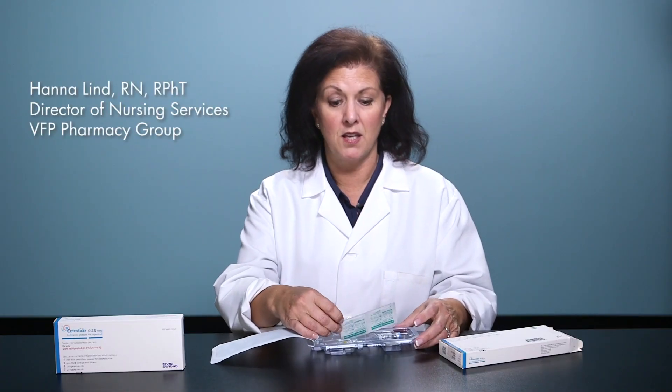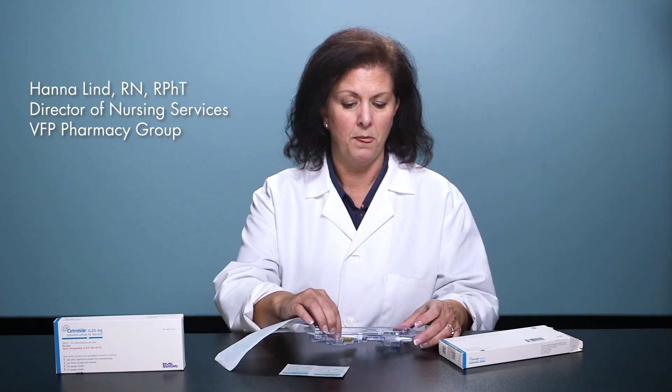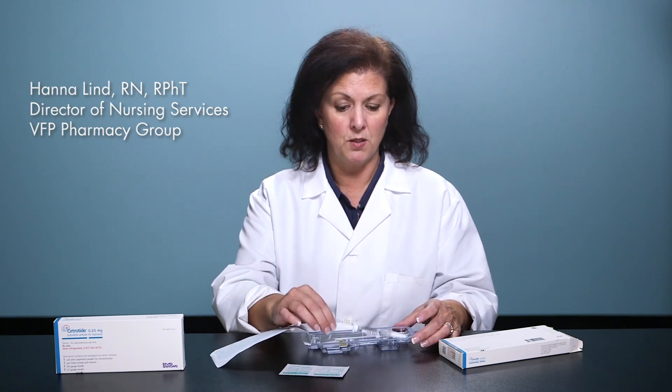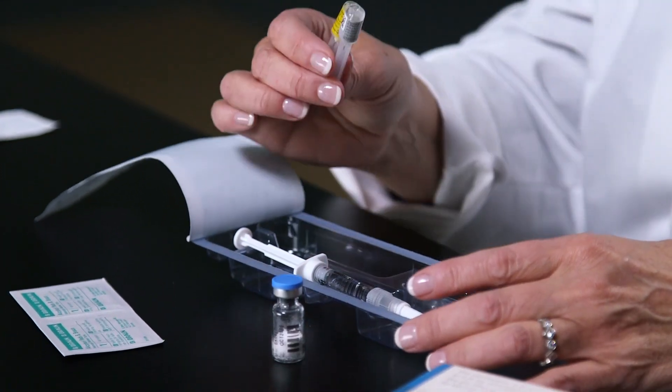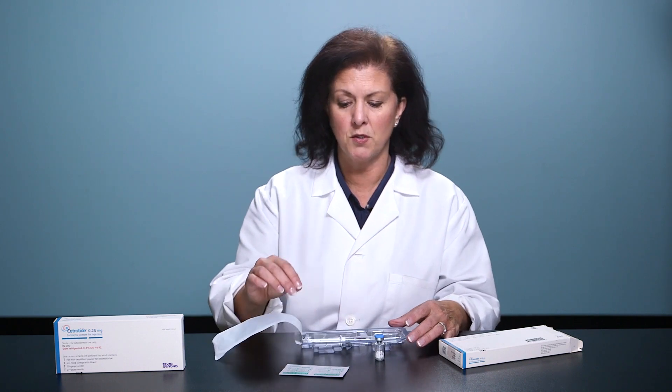In this little kit, it's all self-contained. We have the alcohol wipes, a pre-filled syringe of diluent, the vial of Cetrotide powder medication, and two needles — a long needle for mixing and a shorter needle for injection. This is a subcutaneous injection.